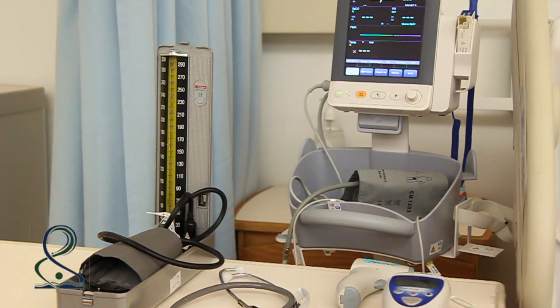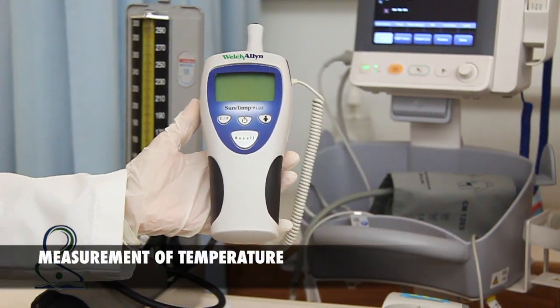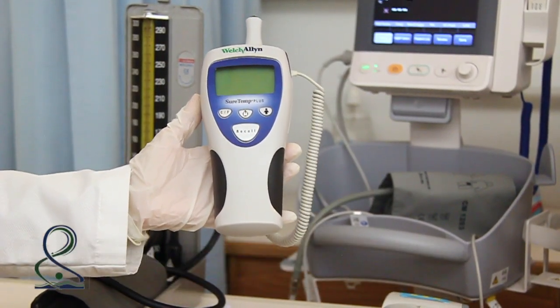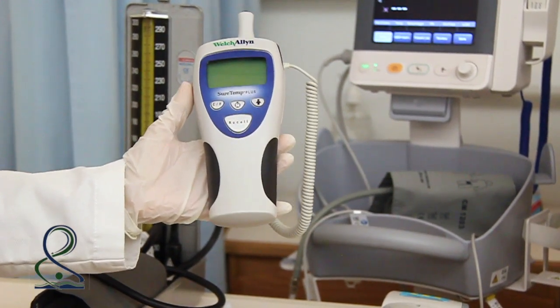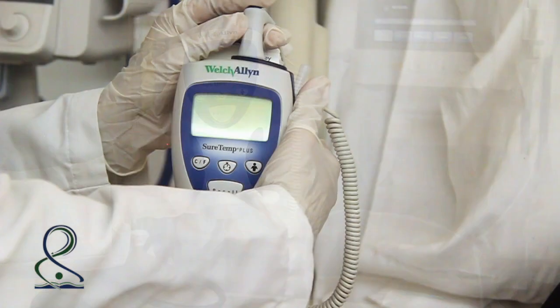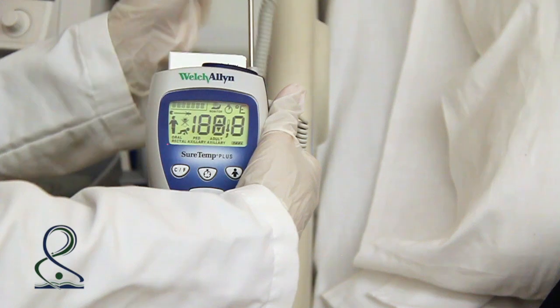We will start with temperature. Gather the thermometer, identify self, and verify the client's identity. Use the thermometer, apply gloves, and position the client appropriately for the device and route. Hold the thermometer and apply a probe cover on the thermometer stick.